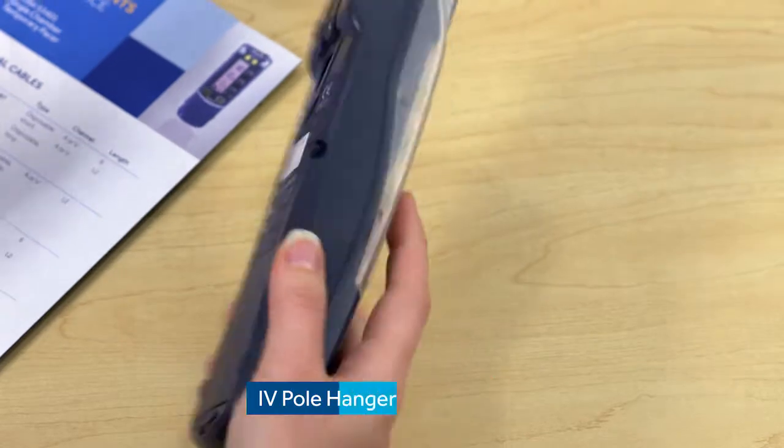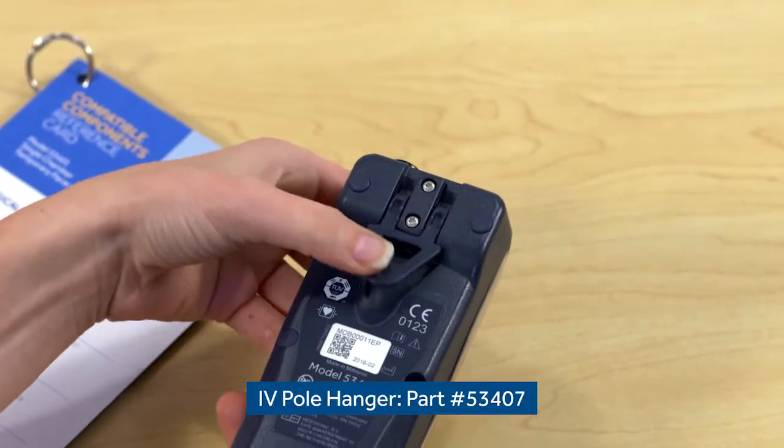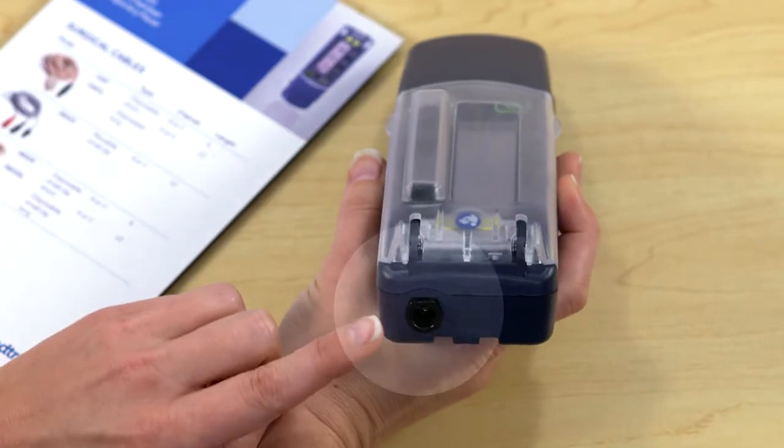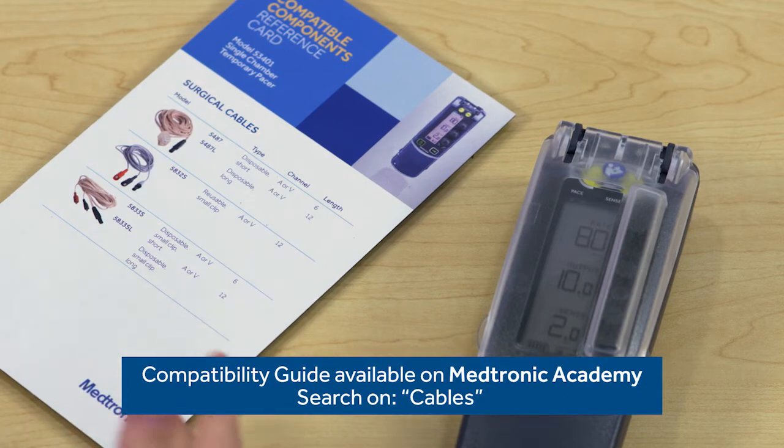Another feature is the IV pole hanger. When it's not in use, it folds flat. Are we able to continue using the same cables? Yes, and here's the cable connector port. I brought along a copy of the compatibility guide so you can use it to see if cables are compatible with this device. That's a helpful resource.